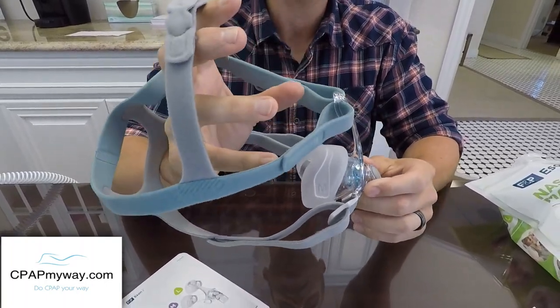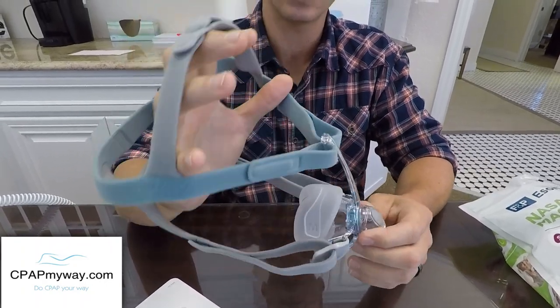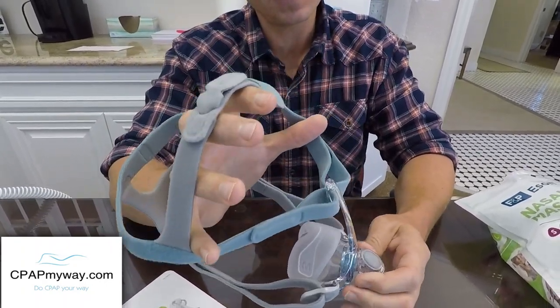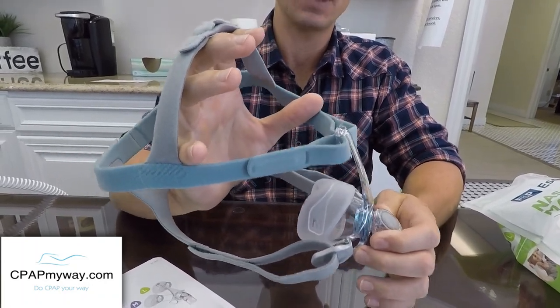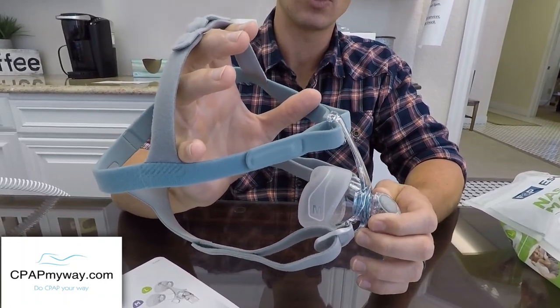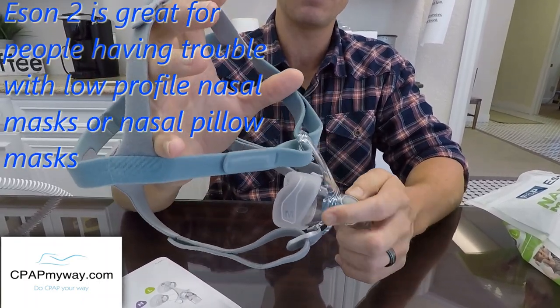The downside is also the headgear, I'll say. It's a lot of headgear if you're a person that really doesn't want anything on your head. This may not be the mask for you. But if you're a person that needs stability of the mask, you've had some of the more low-profile masks sliding around or causing leaks, this is a really good option for you.